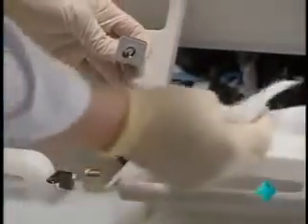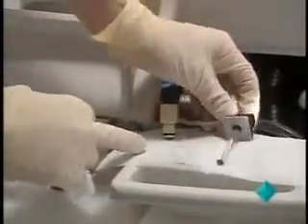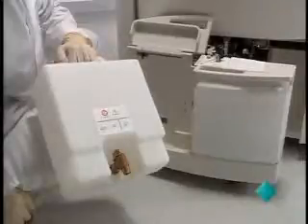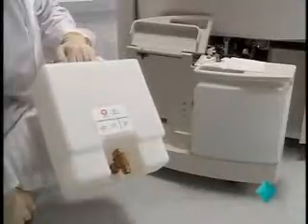Remove the sensor. Wipe the sensor dry using lint-free tissues or gauze, and then set the sensor on lint-free tissues or gauze. Lift the waste bottle up and out. Using the waste valve, empty the contents of the waste bottle into a container or drain approved for biohazardous waste disposal. Ensure that the waste bottle valve is closed properly.